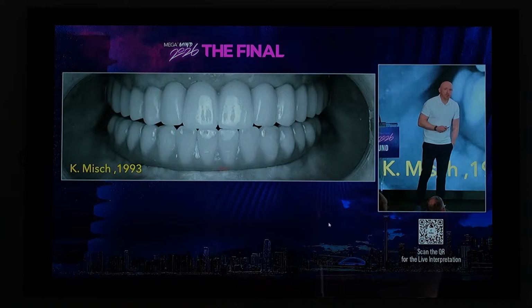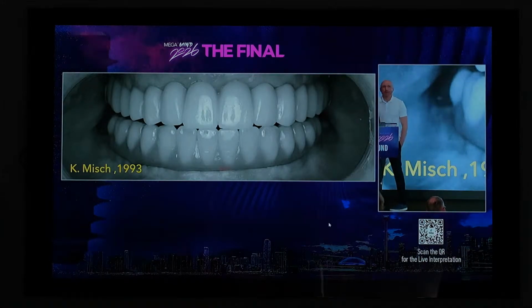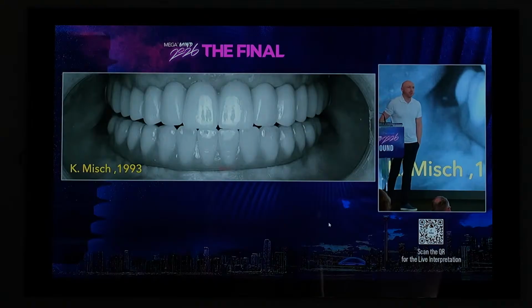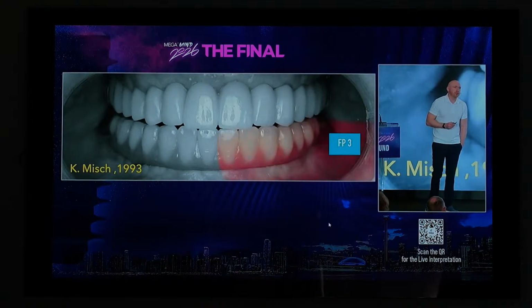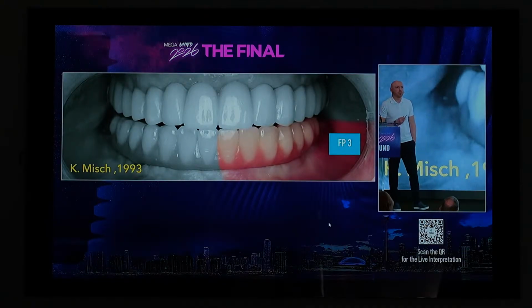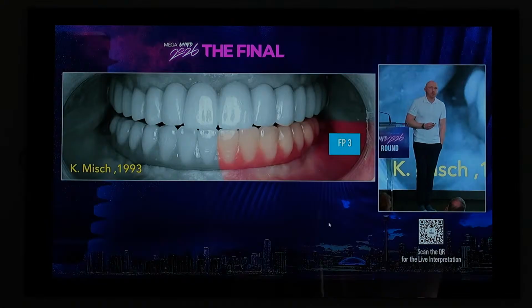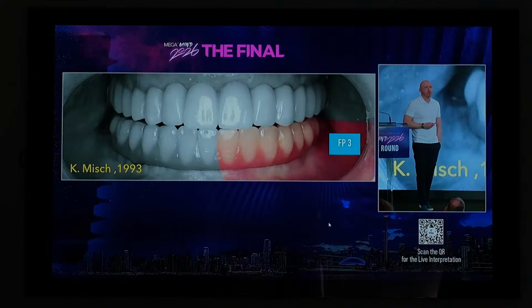Carl Misch in 1993 presented to the Dental Society the classification of prosthetic construction, and we are mostly interested, when we speak about implant-supported rehabilitation, in two types of them. FP3 type, the first one, is about manual technique, freehand implantation, and artificial gum.